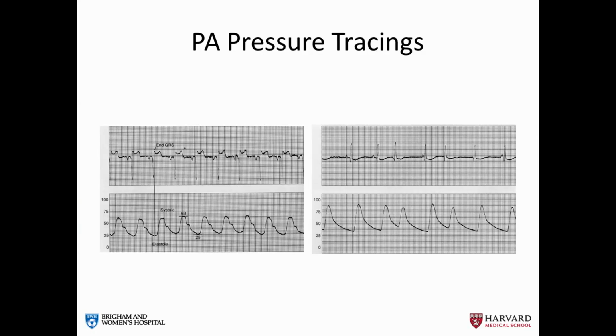These are typical pulmonary artery pressure tracings and how we measure them. Generally, we use the same calculation for mean pulmonary artery pressure as we do for mean arterial pressure. That is the systolic pressure plus 2 times the diastolic pressure divided by 3. Just like with the CVP, we measure it relative to the EKG, and things are a little bit further downstream, and this reflects ventricular contraction.